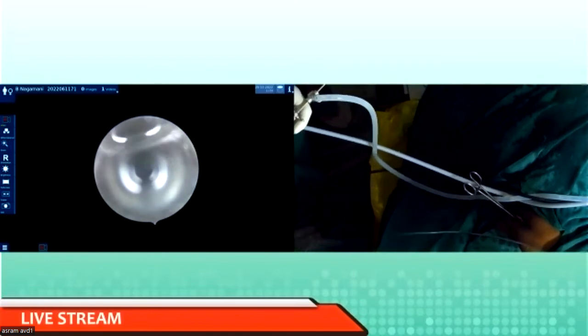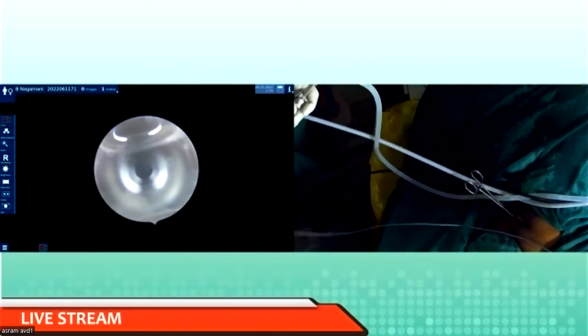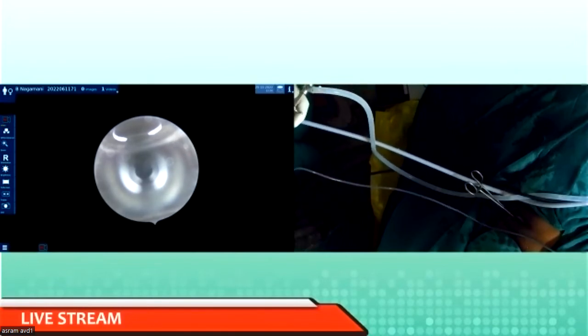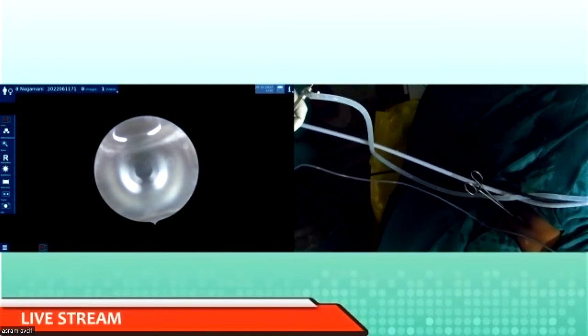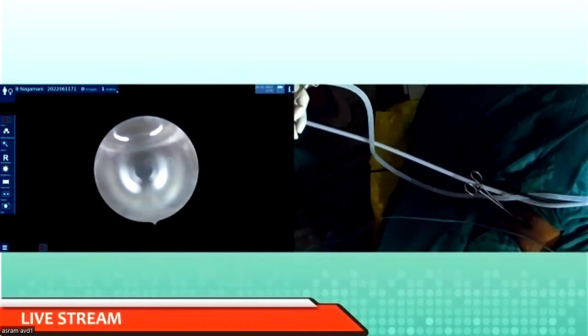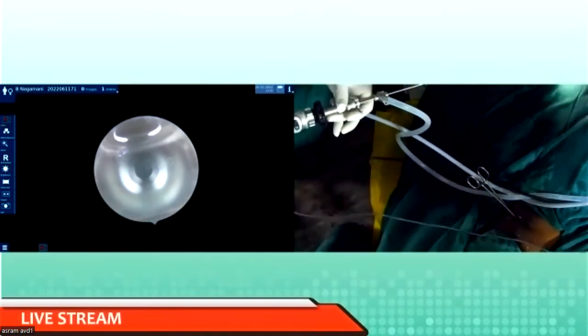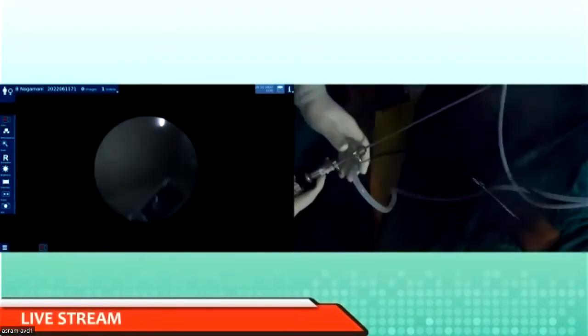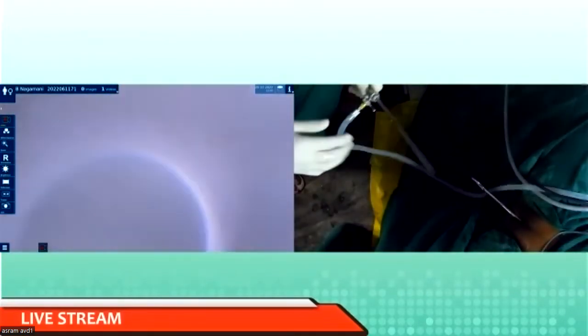One is like a dripping. The other one is when I really removed this. So when I am doing this, I increase the pressure. I should not go by that machine. It is showing 150. No, not more than 150, not more than 150. Okay. Got it, sir. Got it, madam? I hope I have answered your question. Yes, sir.